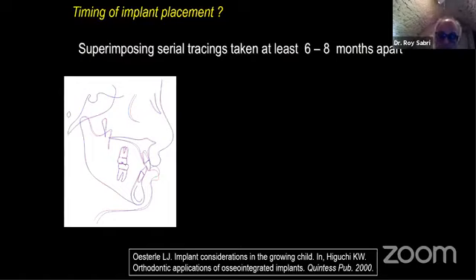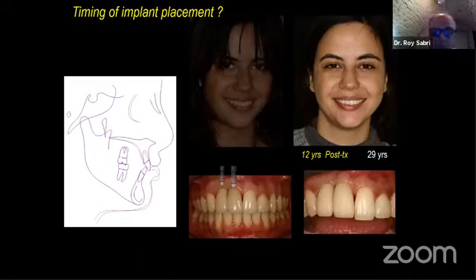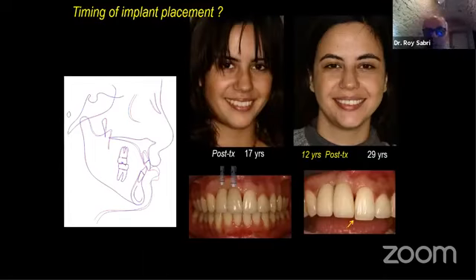But the best way to know the end of growth of our individual patient is superposition tracing. And for boys, we wait till 18, 19. Boys continue to grow till 20. So at 18, 19, we can take a first CEPH and do another 8 months later till we get to this complete superposition. For girls, we can do the first CEPH at age 16. Okay, this superposition was for this patient, for whom I did the implant at age 17. There was good no growth on superpositions.